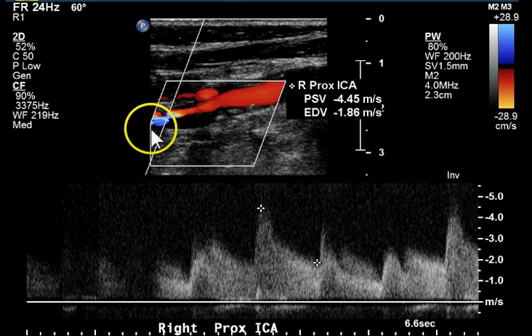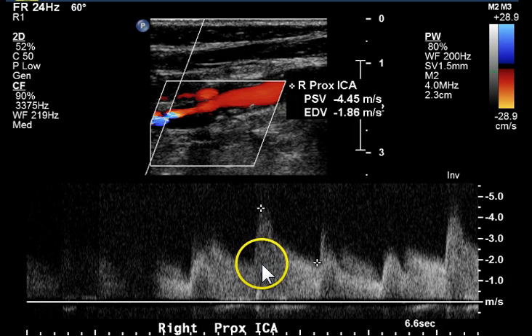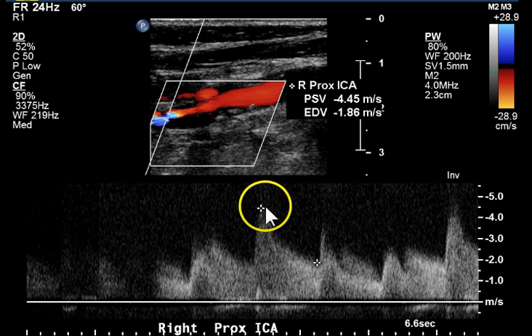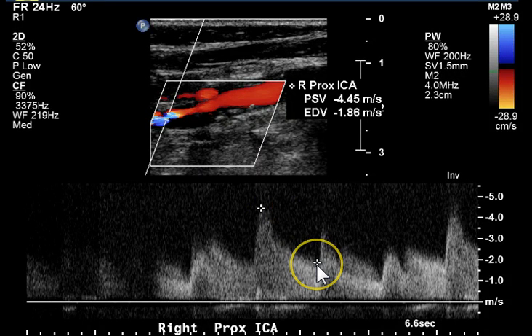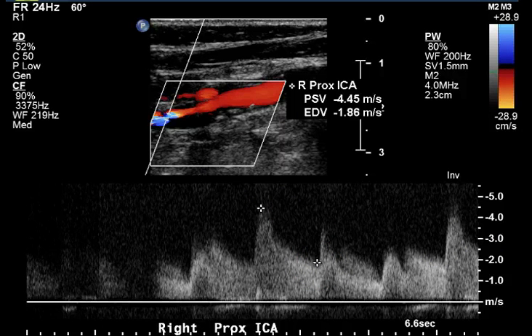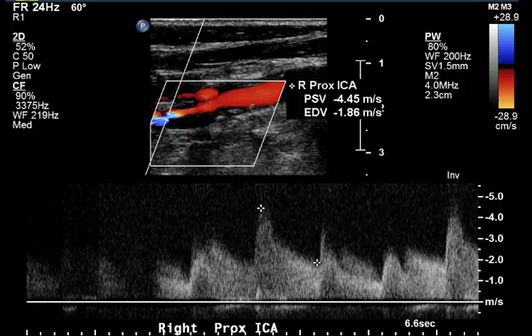Here we're in an area of stenosis in that narrowed flow lumen of the internal carotid artery. The maximal velocity at peak systole is 445 centimeters per second. The diastolic flow is 186 centimeters per second. This indicates a level of disease greater than 70% stenosis.